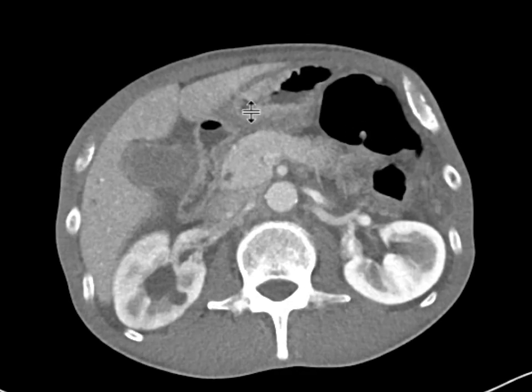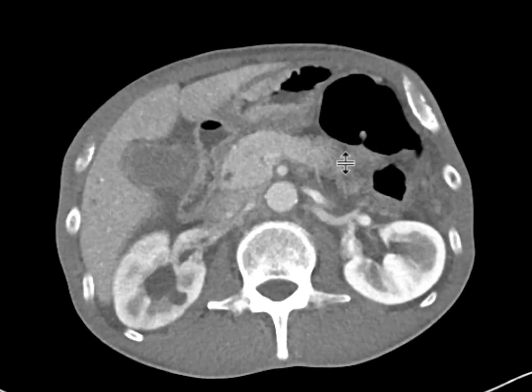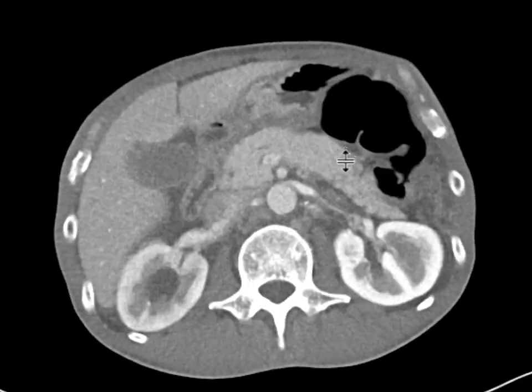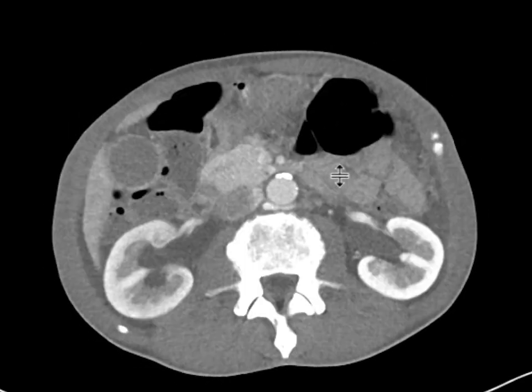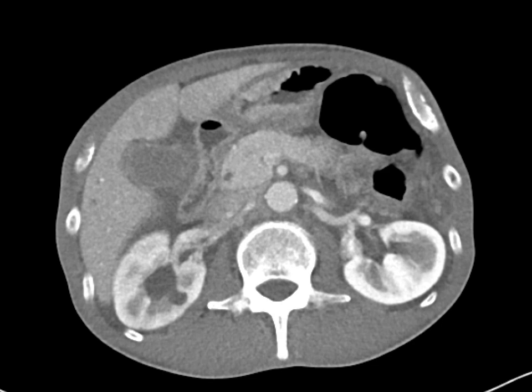As we scroll through on this slice as well, you can see how nodular, thickened, and irregular these loops of gastric folds are compared to some of the other loops. That finding is highly concerning for a gastric neoplasm, specifically an adenocarcinoma. This patient underwent endoscopy and it indeed turned out to be a gastric adenocarcinoma with findings of carcinomatosis in the abdomen and pelvis.